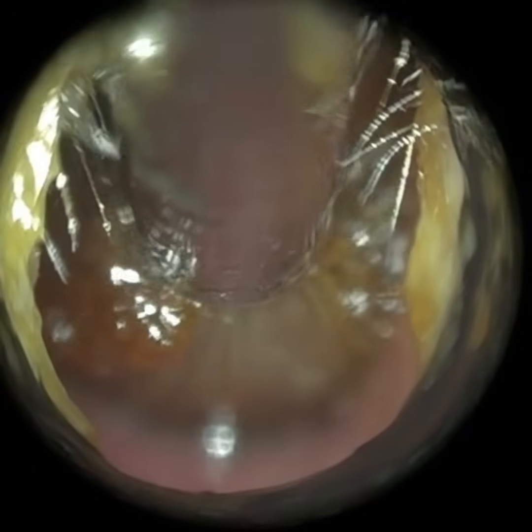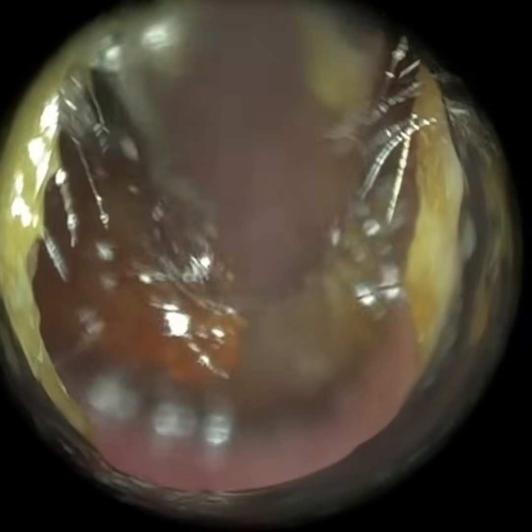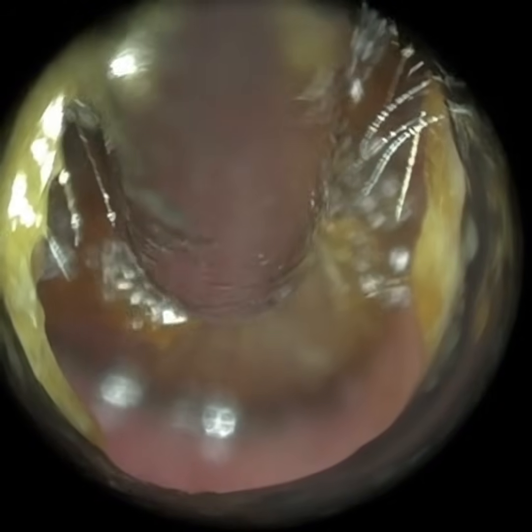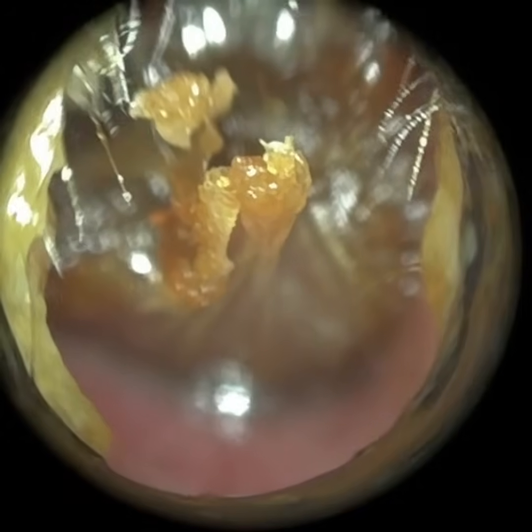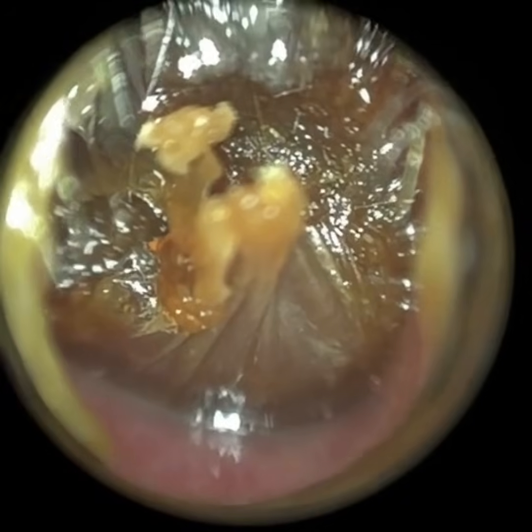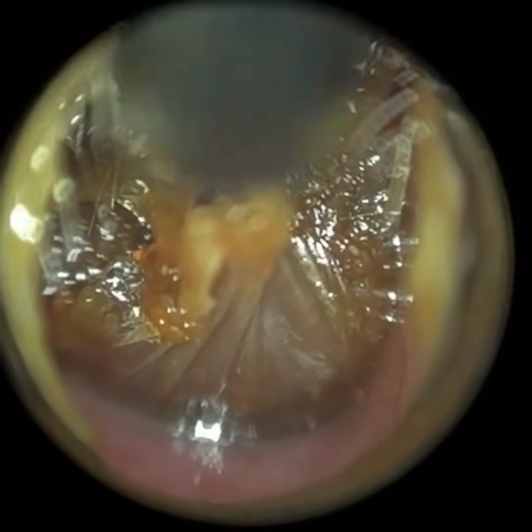We've got a specular there. With an endoscope, the magnifying lens itself, we put it inside the ear. So we've got a bit more, well, a lot more visualization, especially into little divots and crevices, widenings.